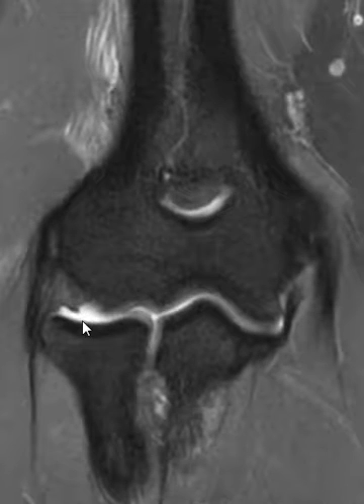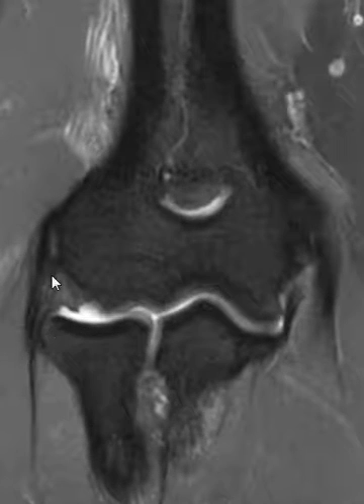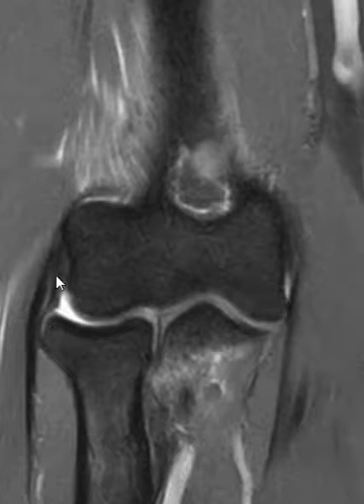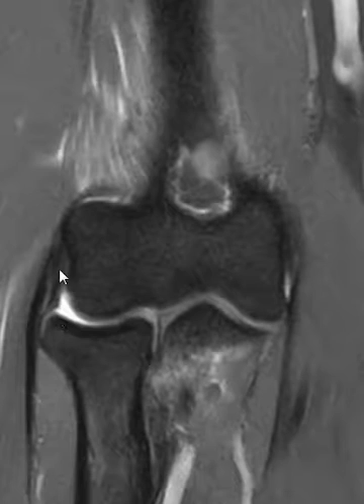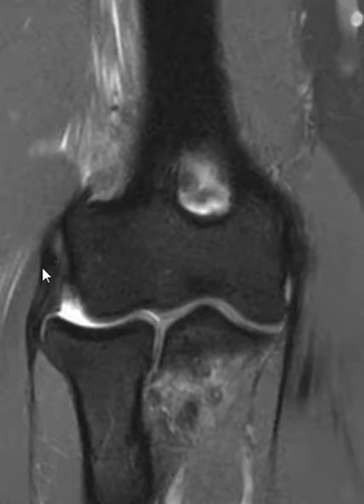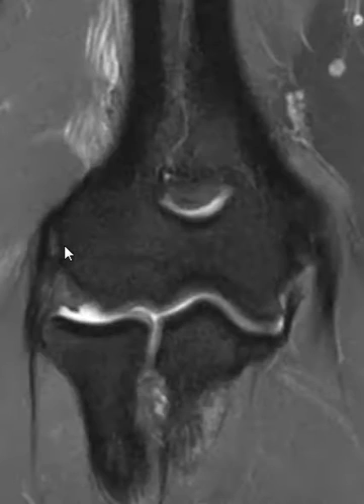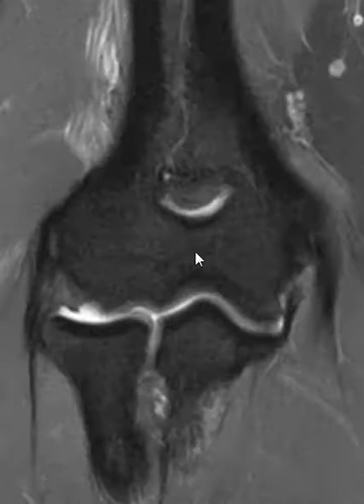Now if we look over on the radial side — this is the lateral side — we see these components: we have the radial collateral and lateral ulnar collateral ligaments that blend together, deep and then superficial. We have the common extensor tendon complex, and they all are bunched together — really can't tell them apart. And that's it. Thank you very much.